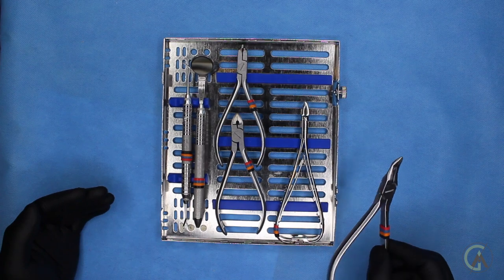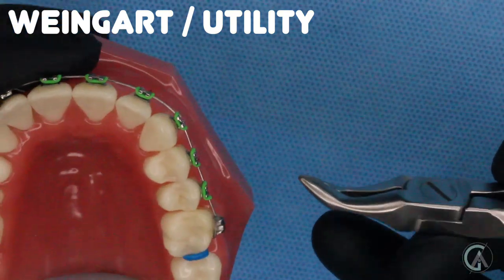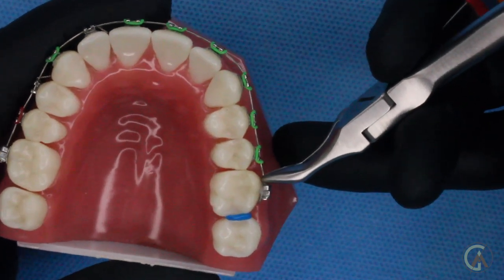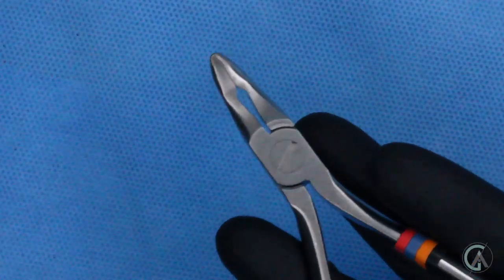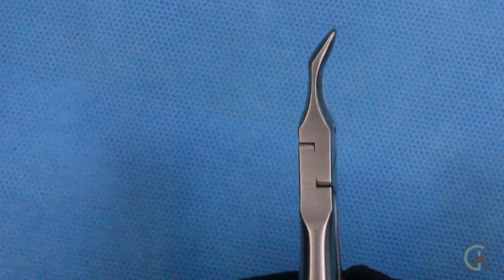Last but not least, our trusty Weingart plier. A Weingart is basically a utility plier used for a bunch of different purposes. The main purpose is when we're putting in the arch wire — sometimes if it's a bigger wire, we can't just use our fingers to slide it in, so we use the Weingart to slide the wire into the braces and put it into the right position. For things that your orthodontist can't just grab onto in your mouth, they'll use something like a Weingart. This one is from Rocky Mountain Orthodontics. Most of the pliers I'm showing in this video are either from Rocky Mountain Orthodontics or Hugh Freedy Orthodontics — those are my two go-to brands.